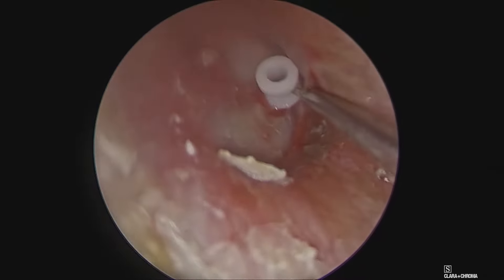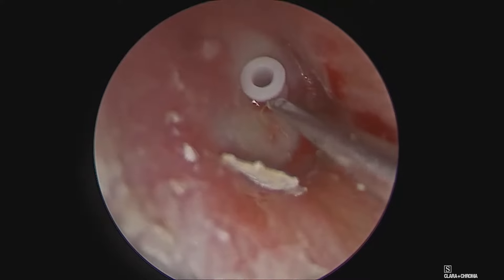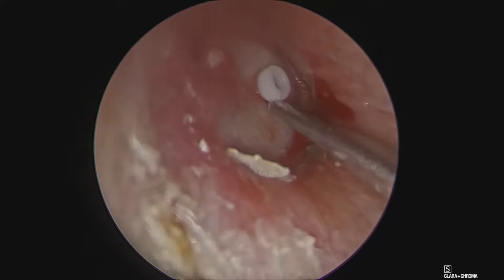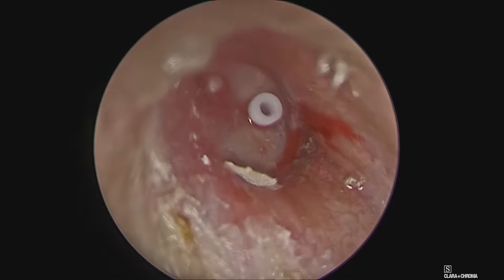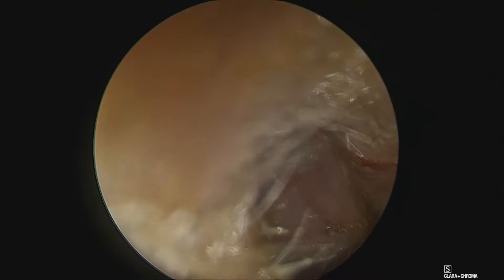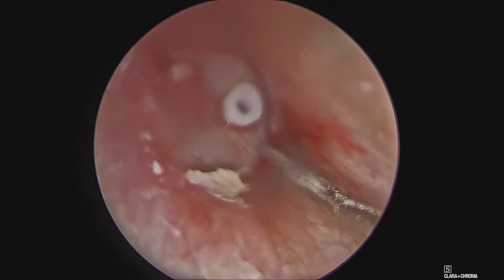Since we are using an endoscope, we are using a single-handed technique. With a snap it goes inside and we have to ensure that it is not loose, so we can use suction again — also to remove any blood clot from the lumen of the grommet.